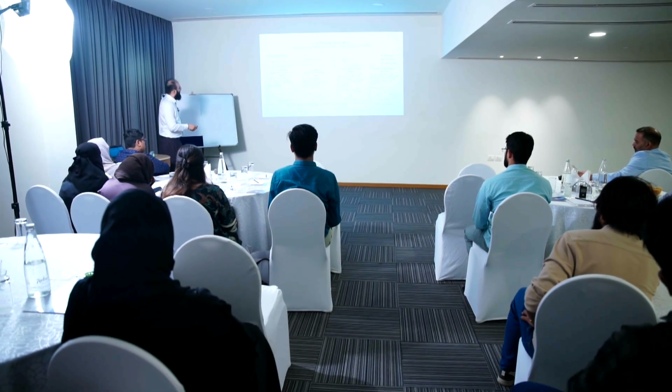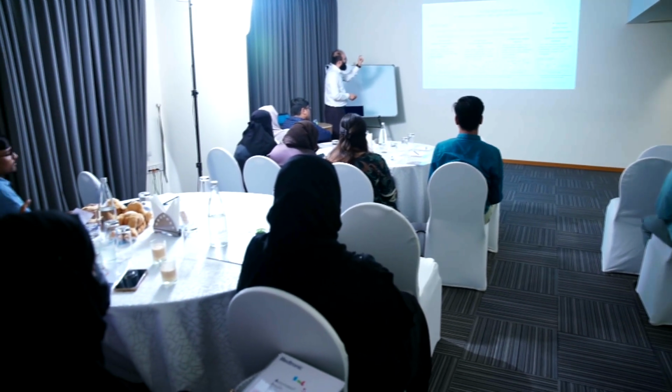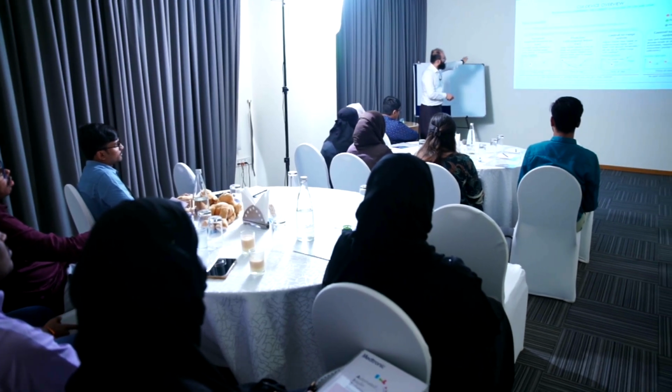Threshold suspend, low suspend on low. It suspends insulin delivery for up to 2 hours when the glucose sensor value reaches a predetermined lower threshold. Say it is 70. You have said that 70 is the lower target. Less than 70, my patient should not go. Once it touches 70, the delivery is stopped.